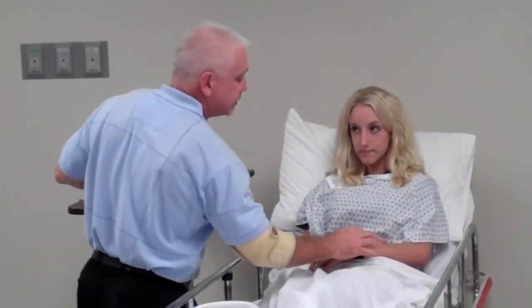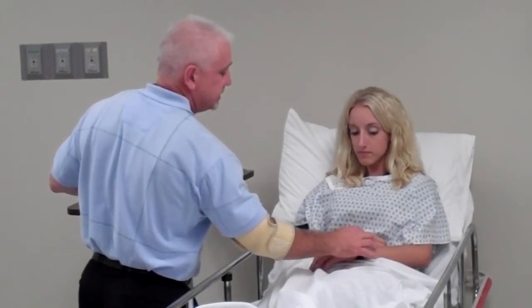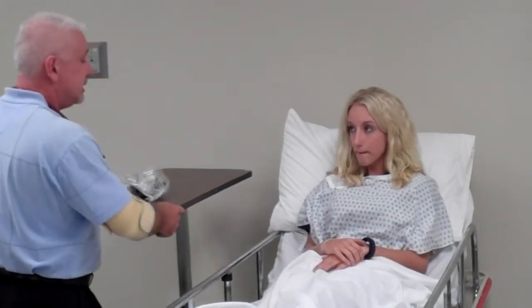The first thing that I would do is check the patient's ID. And it says, Miss Katie, what is your date of birth? 8/15/92. Okay, good. That matches my requisition and her patient ID. Our medical record number and the patient identification number match, so that is appropriate.